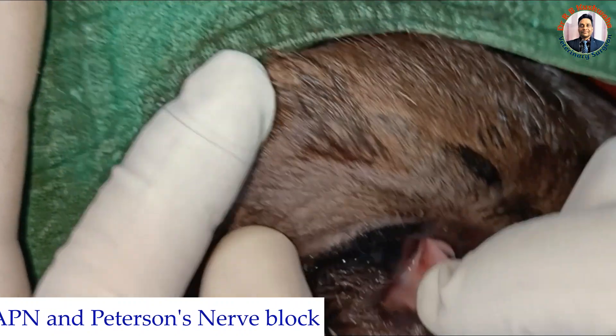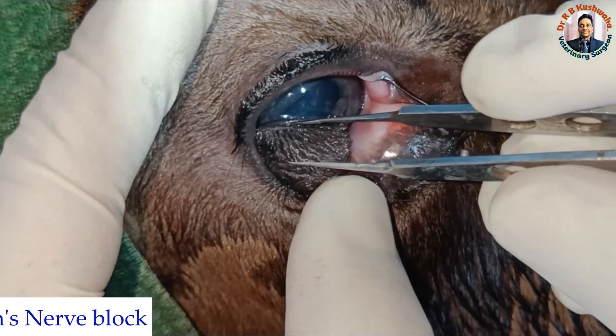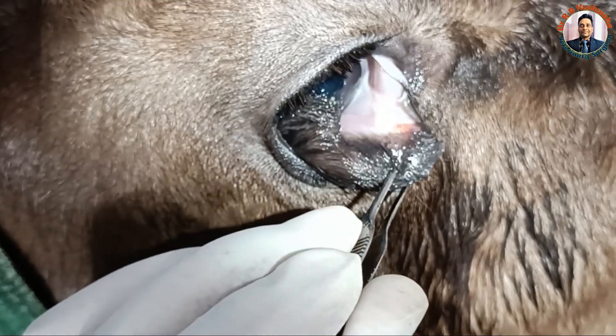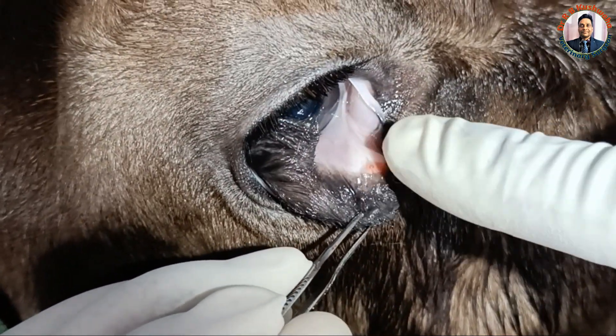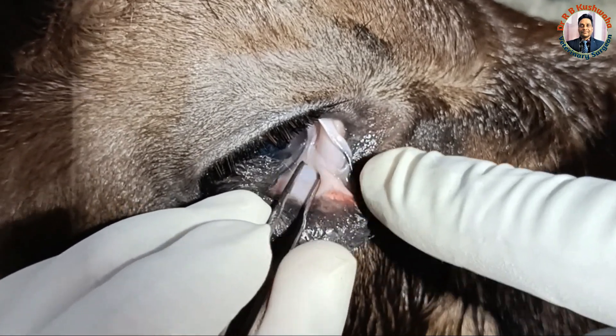In this particular case, if you see, it is attached with the cornea. You could see here — it is attached with the cornea, and this one is also attached with the palpebral conjunctiva and to a certain extent with the bulbar conjunctiva.